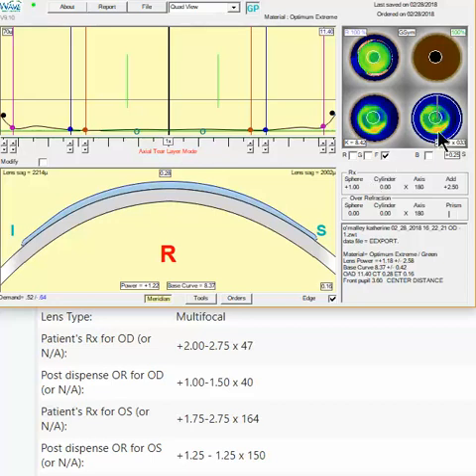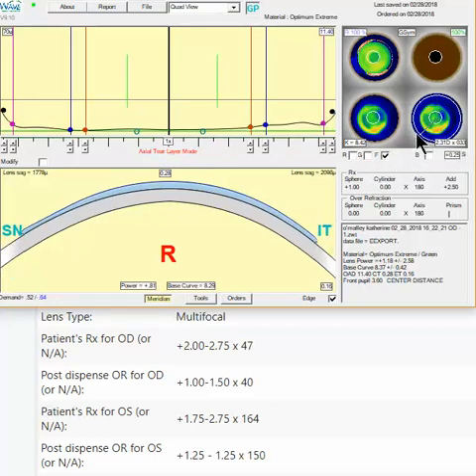You are in freeform, so you can go down here to about the 8 o'clock radial, and you can just click down on that blue dot a few times. Hold on, let me switch it back to 25%. Okay, 25%. If you click down on that radial, you'll see it just brings down that one meridian very nicely.